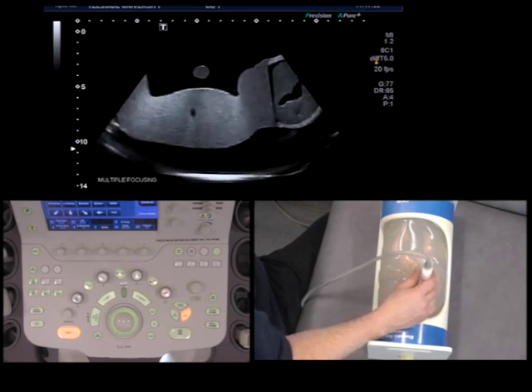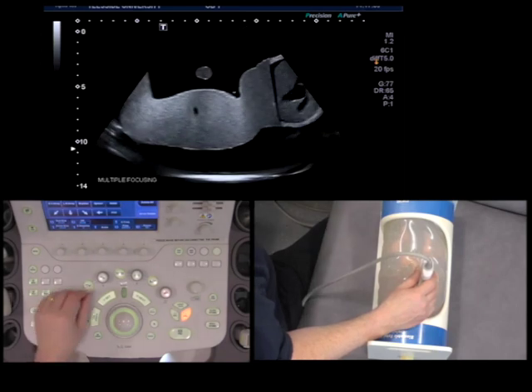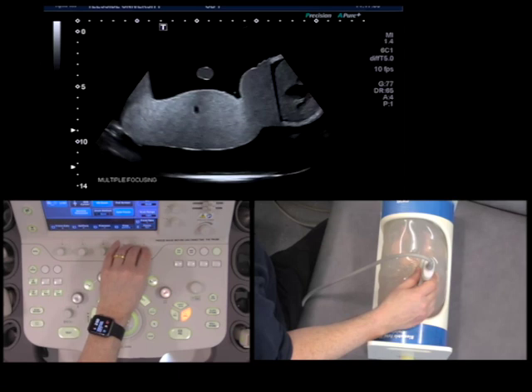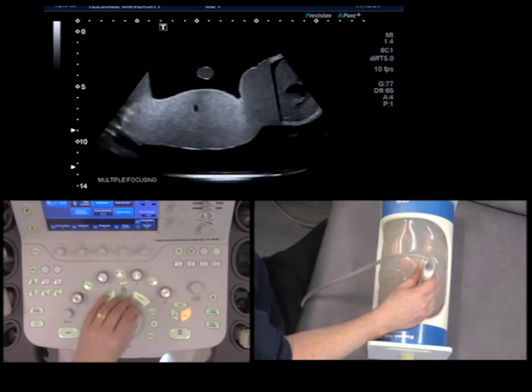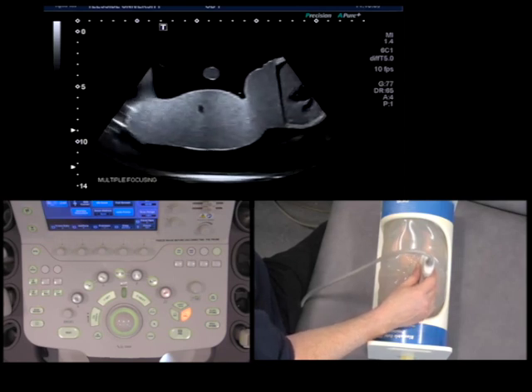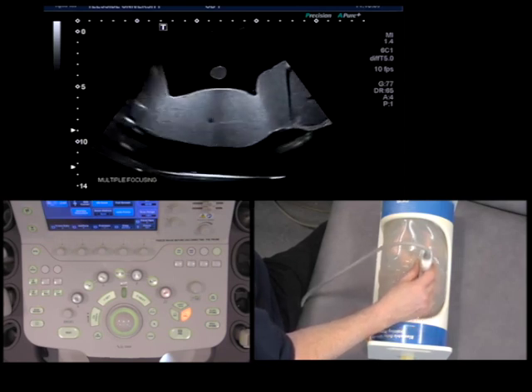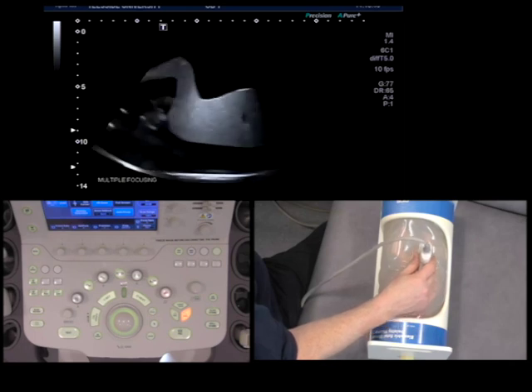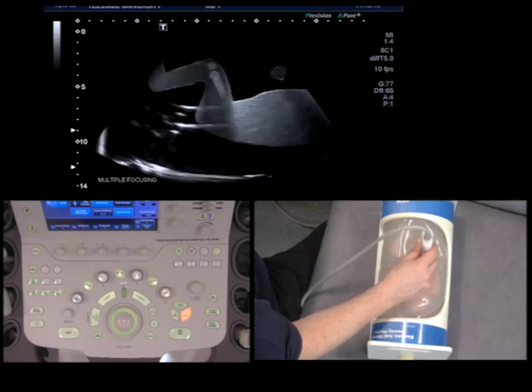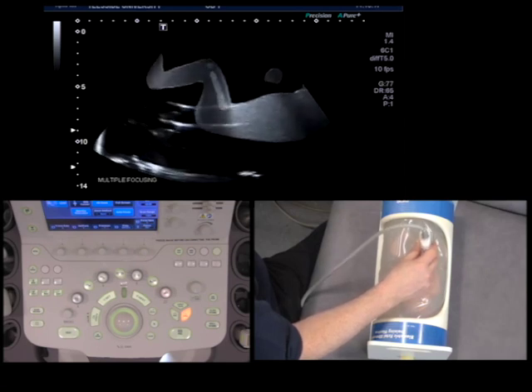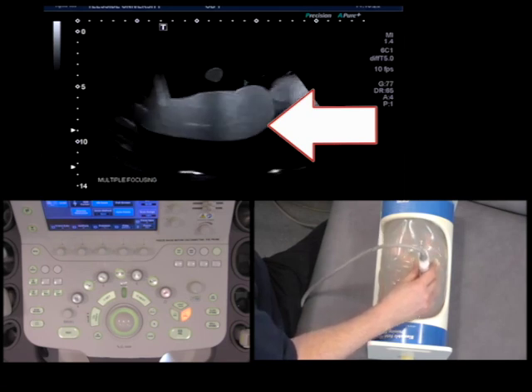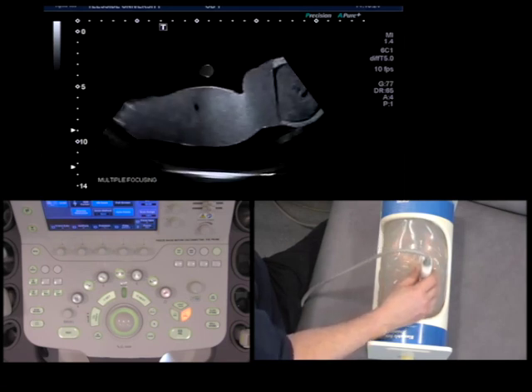That's what we want. Now, if I then increase the focal zones, look what happens with the frame rate — it reduces to 10. If I move my hand, the image is no longer keeping up. And as I move quickly, you can see a nice reverberation artifact there right in the center of the screen. The image is not keeping up with my hand.